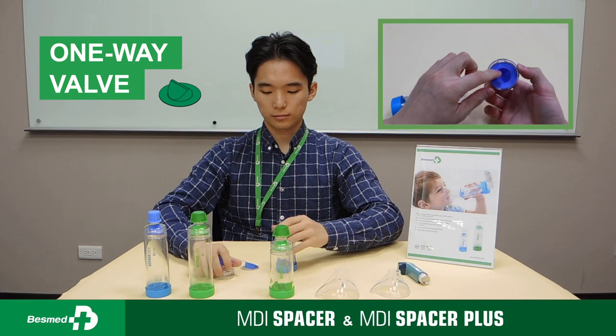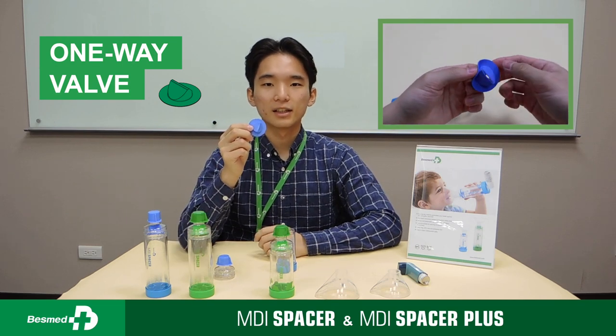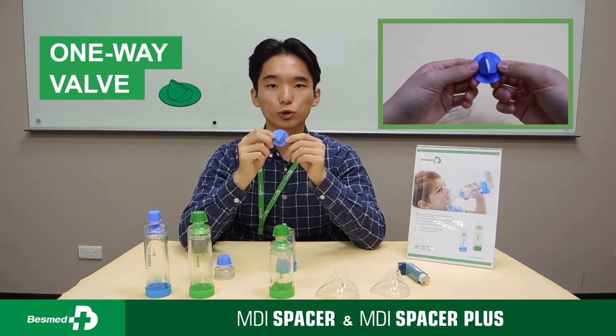Number three: the one-way valve. As you can see here, it is designed to minimize drug residuals.